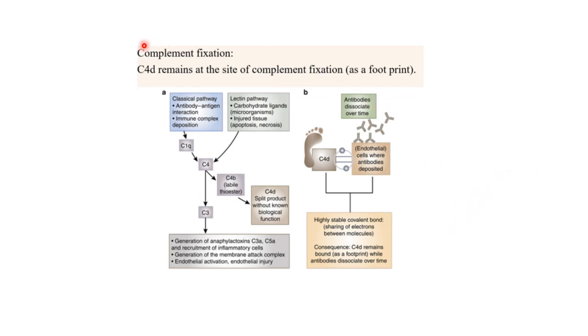We come to complement fixation. It's outside the scope of this talk to discuss complement in detail, but suffice to say C4d is a mark of complement having been fixed. It is a highly stable covalent bond and it remains bound as a footprint while antibodies dissociate over time. So wherever there has been complement fixation, C4d remains there as a footprint that complement fixation has taken place.